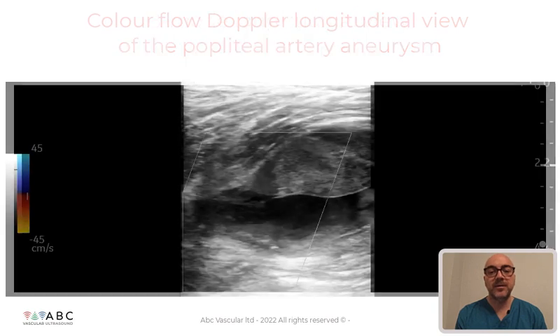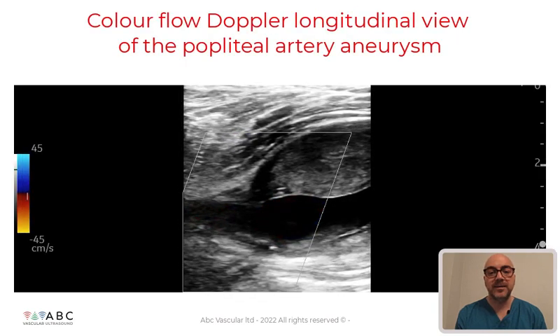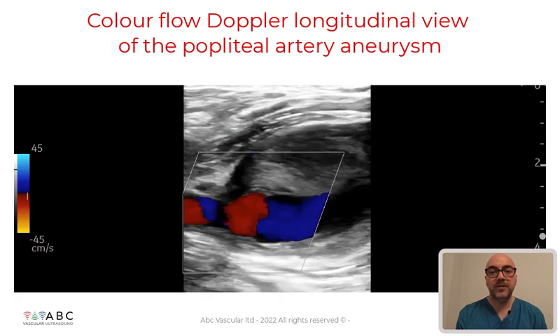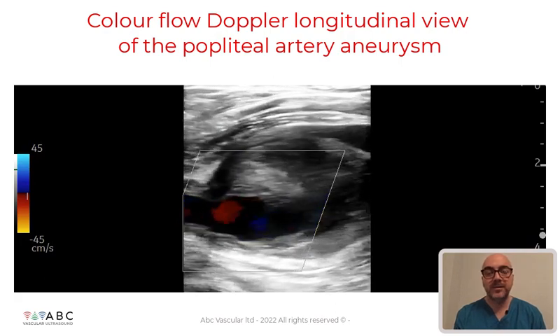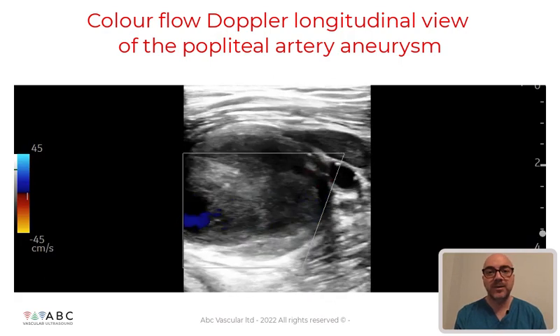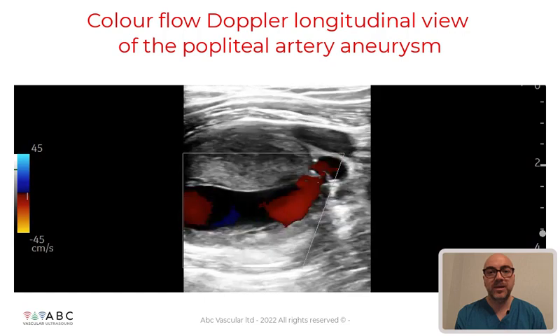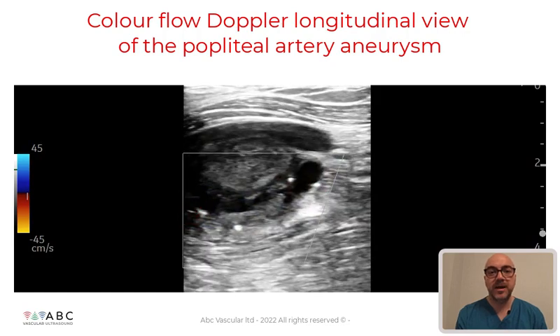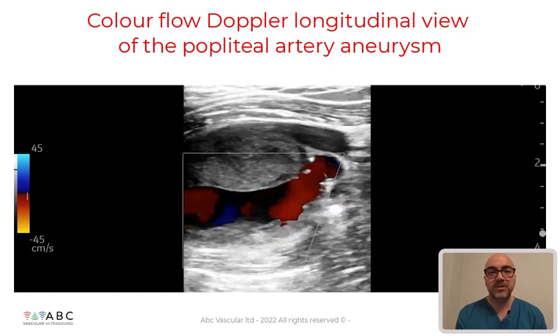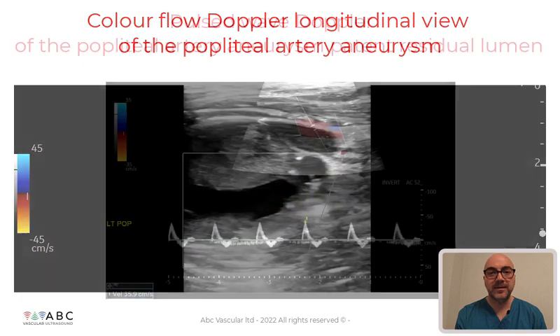To confirm that the lumen is indeed patent, we apply color flow Doppler, which demonstrates the presence of pulsatile spontaneous flow within the patent residual lumen without any regions of color flow aliasing.